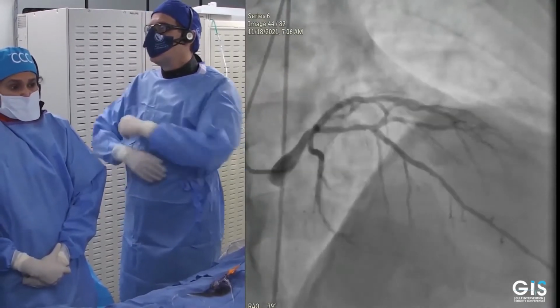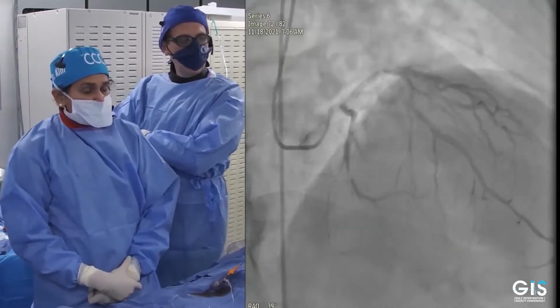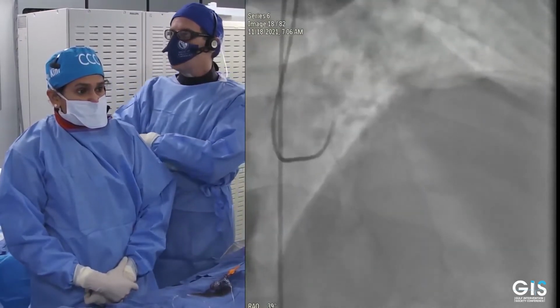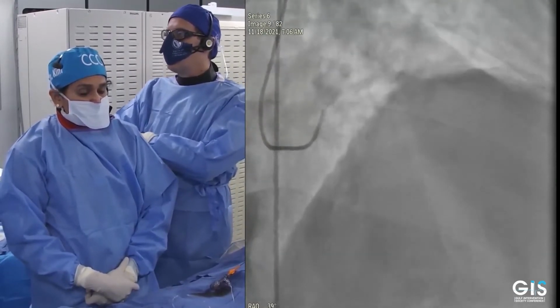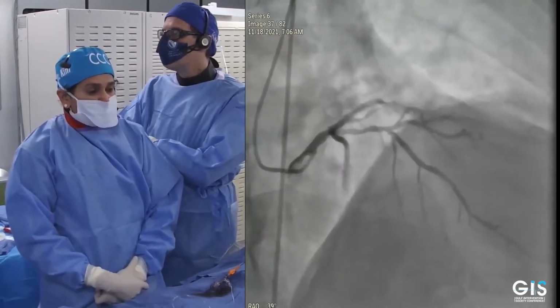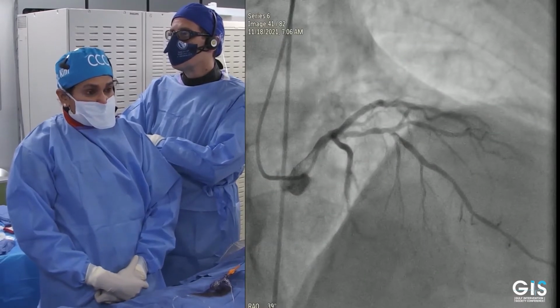And that's where we are now, in the significant calcific proximal LAD with positive FFR. And we'll have a diagonal coming off. So what do you say, Dr. Kinney? What is the Medina classification here? 110 or 100? Now, angiographically, if you see, we will call it 100. But since we have done physiology, it has made it into 111 now.